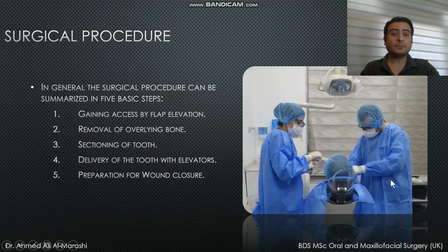So all the procedures need to be done with personal protection regarding eye protection, eyeglasses, mask, head caps, sterile gowns and surgical gloves. The patients also need to be prepared properly by disinfection of the skin, disinfection of the oral mucosa, head cap, sterile towels, and so on.